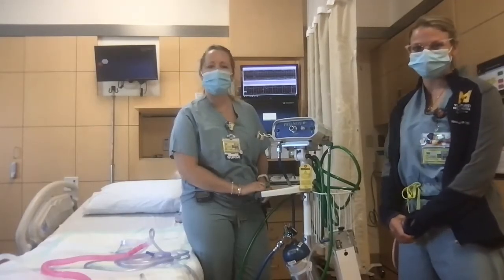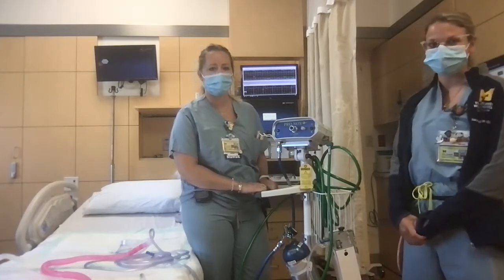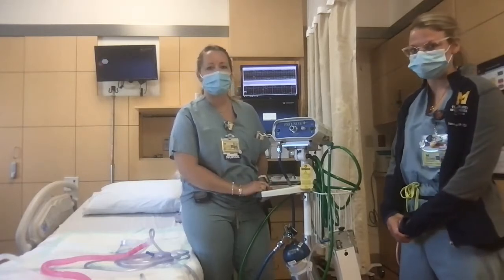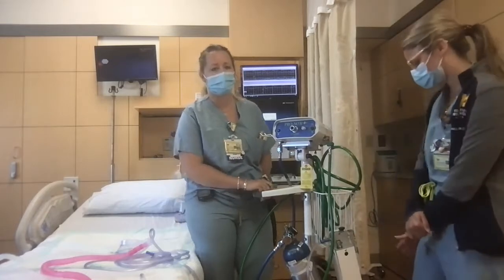Hi, I'm going to do a quick little video to help demonstrate how to set up nitrous for your patient. The first thing I'm going to do in the nitrous room is a double check with another nurse to make sure that the tank is off and safe.